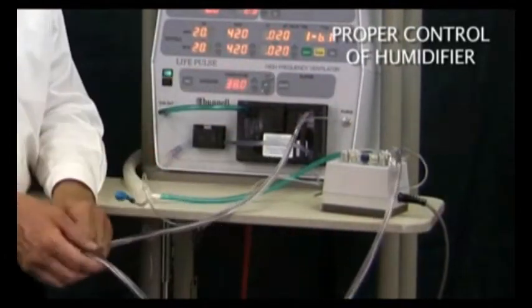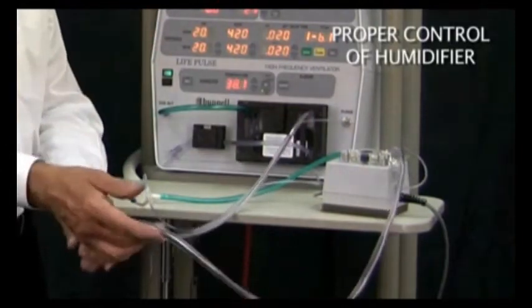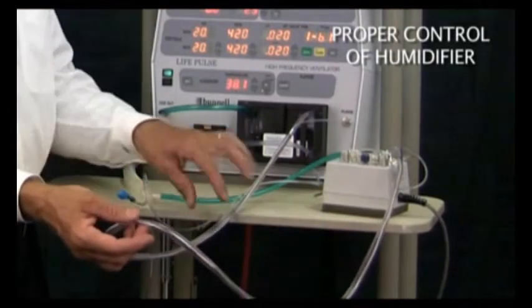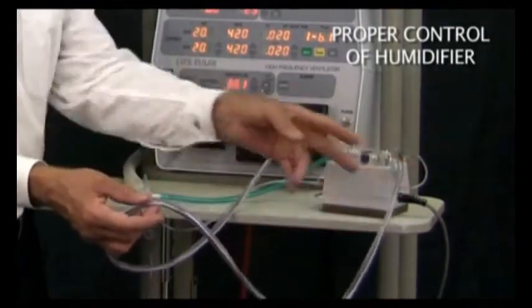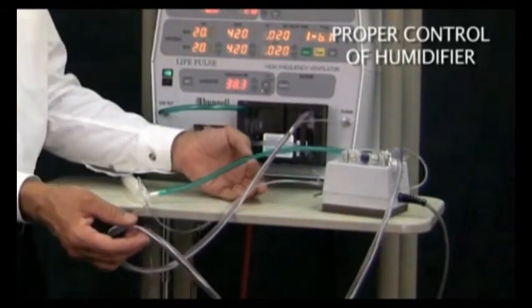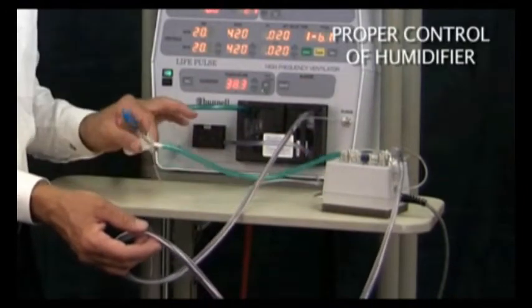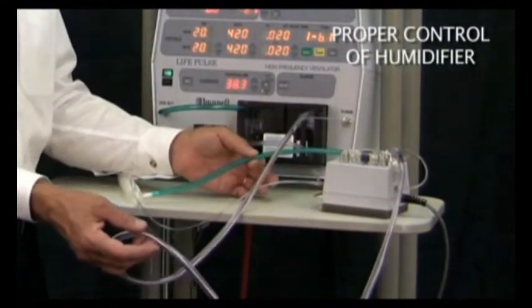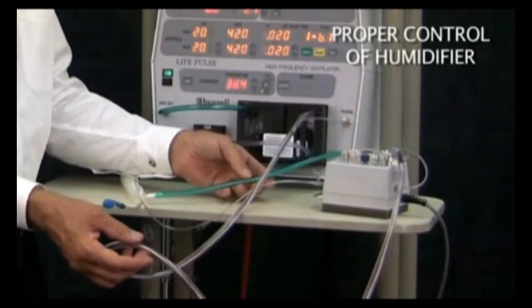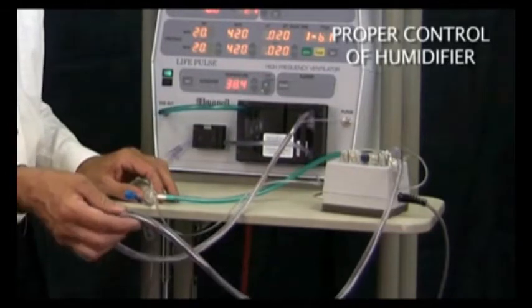The goal in controlling humidification is to try to keep this segment of the circuit relatively dry, with just small patches of mist or fog in places, and making sure that the condensation in this part of the circuit between the patient box and the endotracheal tube adapter has a nice thick coating of mist or fog on it, so that you can quickly check to make sure that the patient is receiving adequate humidification.